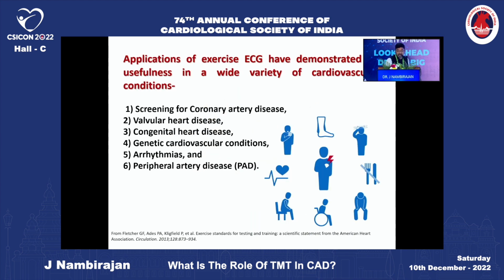So the application of exercise ECG has been used primarily in the screening of coronary artery disease, and it has also found its application in various valvular heart diseases, especially moderate aortic stenosis and regurgitant lesions, certain congenital heart disease, genetic cardiovascular conditions, and in evaluating arrhythmias and peripheral artery disease.